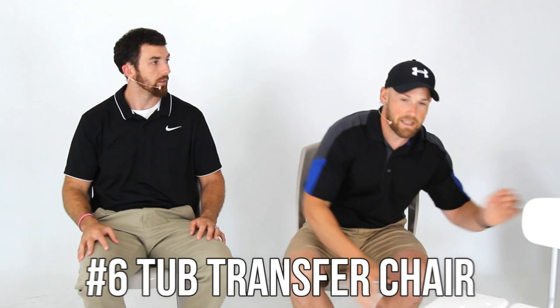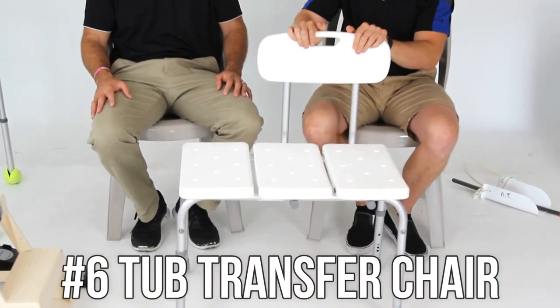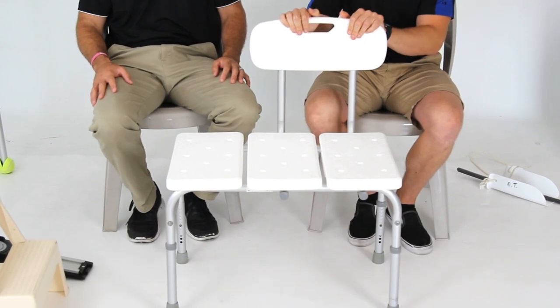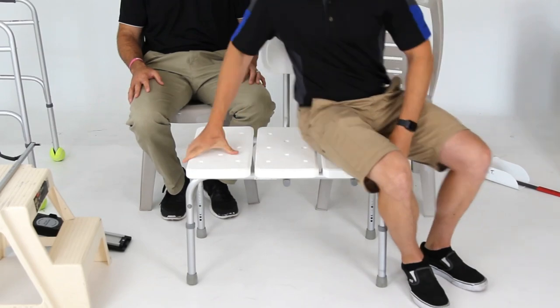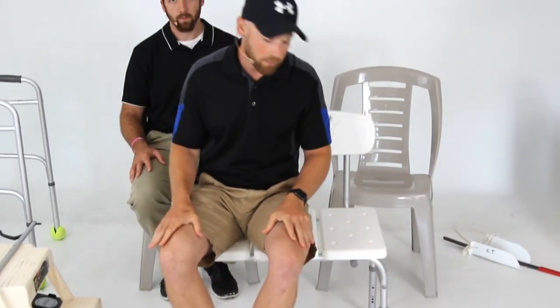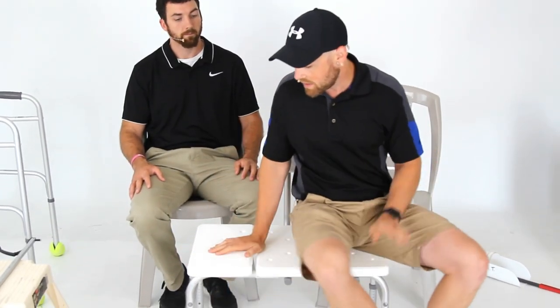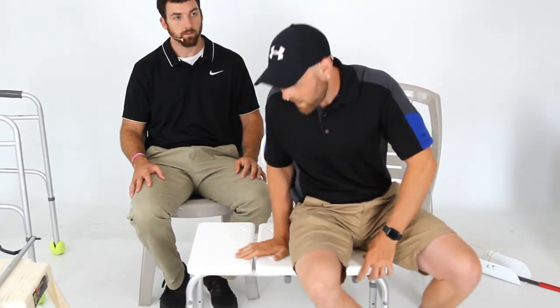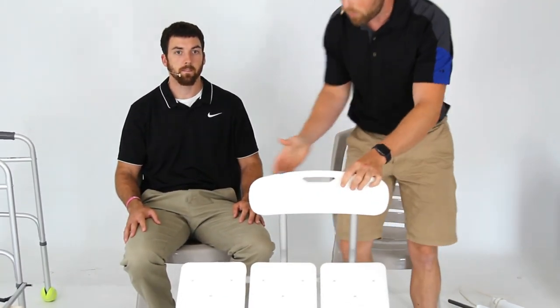Number six is a tub transfer chair, used to get in and out of the shower. You place it half in the tub and half out. That way, if you're not steady getting in, you can sit your butt on it and lift your legs over the tub to where you want in the shower. Some people later leave it inside the shower so they can sit down while actually showering. They're plastic so you don't have to worry about rusting or corrosion.